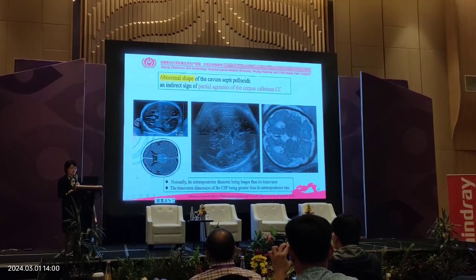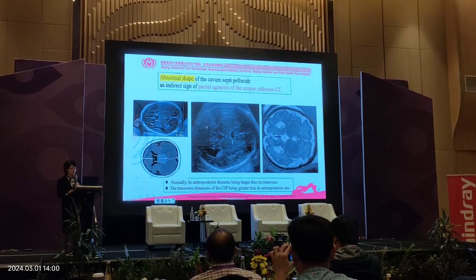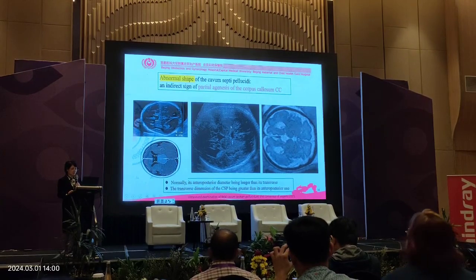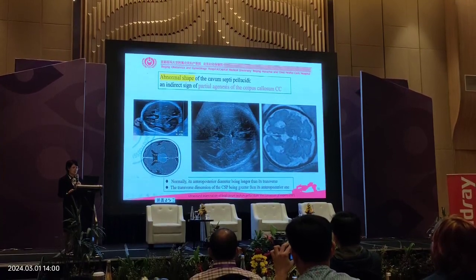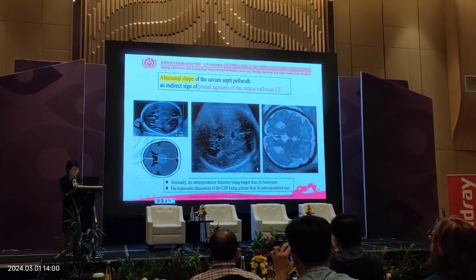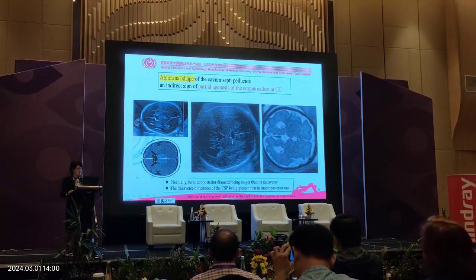This one here. Normally it's a square or triangle, but this one is wider. The length is smaller and the width is bigger. The measurement is like here.